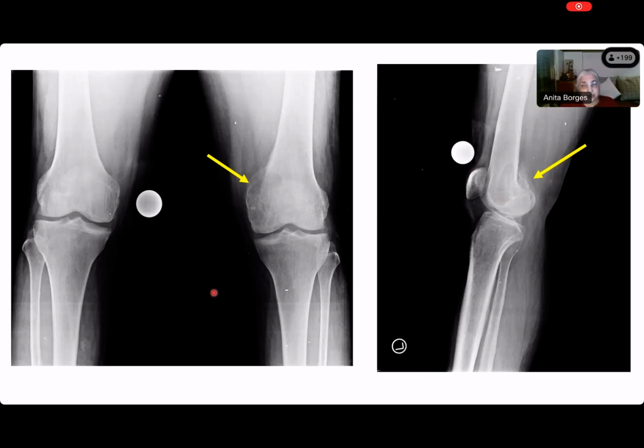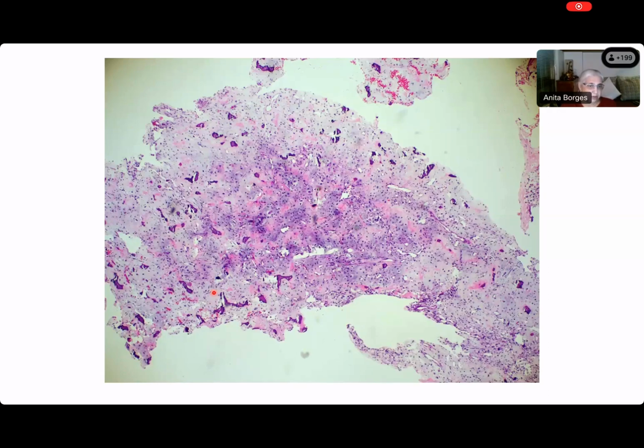So let us see now. This was a needle core biopsy. Now come on, Sarangi. You think this is a giant cell tumor? No, here the osteoclastic giant cells are not visible on this slide. But can it still be a giant cell tumor? What do you see? It is cellular. Okay. It is cellular. The slide is. What do you see when you look at it?